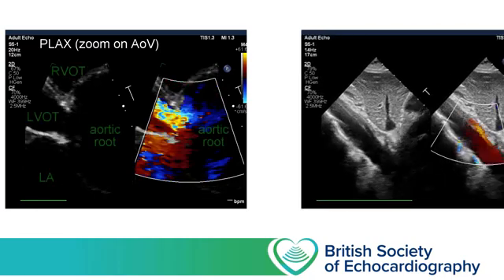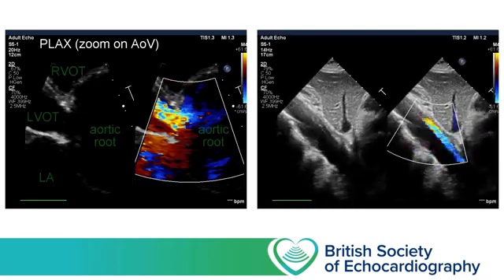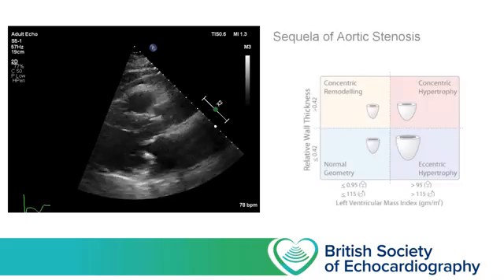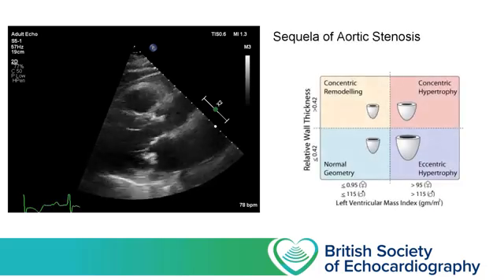to see a clear aortic dissection in the abdominal aorta when panning to the left from a standard subcostal IVC view. Type A aortic dissection was subsequently confirmed on a CT aortogram. This case nicely leads us on to think about the consequences of aortic valve lesions.